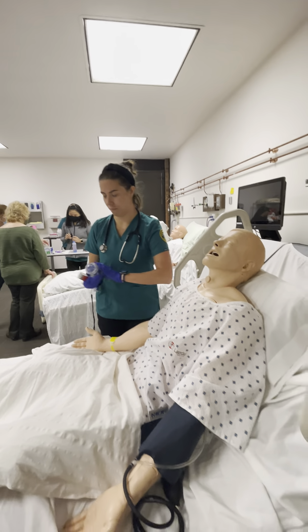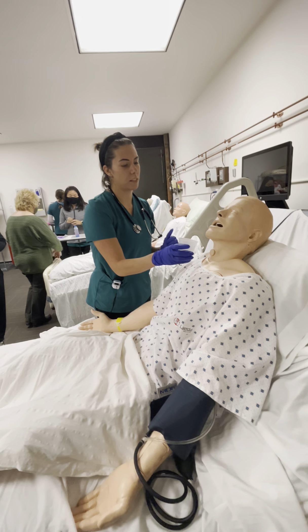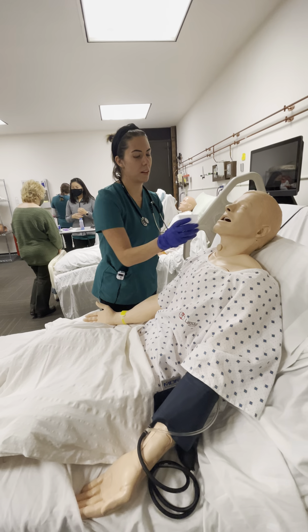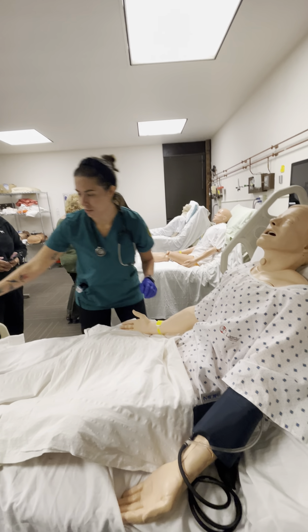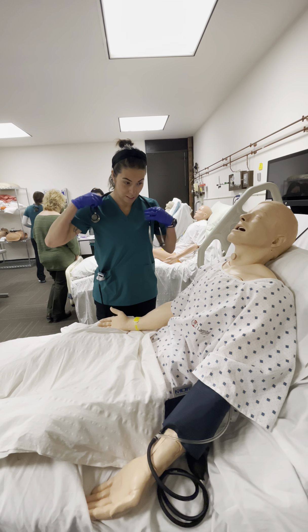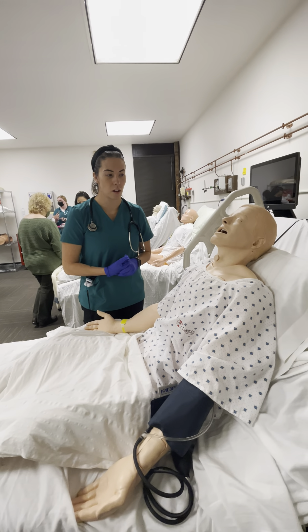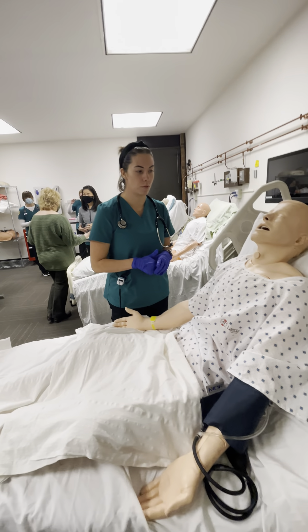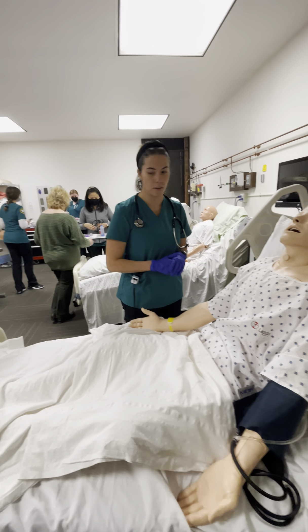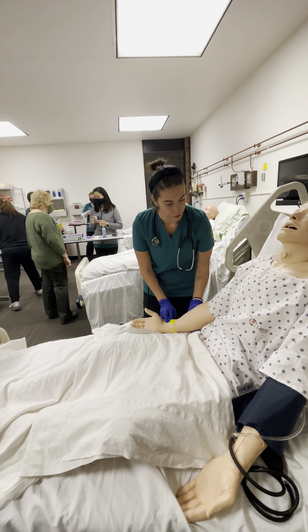How are you feeling? Good. Let's go ahead and rinse out the medication — swish it around a little bit and spit back into the cup. The reason we do that is so you don't potentially get thrush, which is a fungus that can grow on your tongue. Very painful, okay? So you want to make sure to rinse with water each time you use that inhaler.